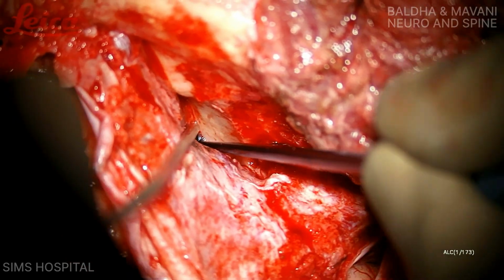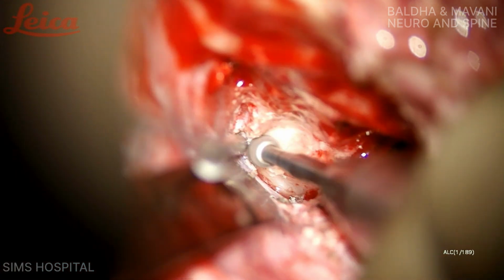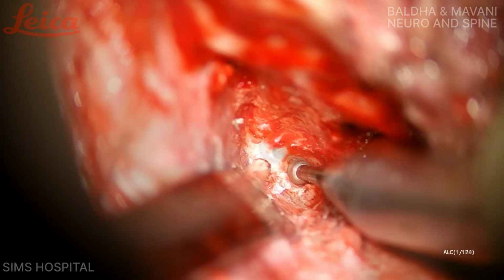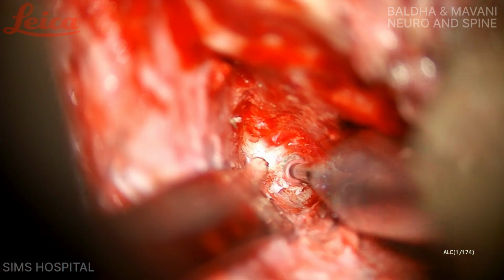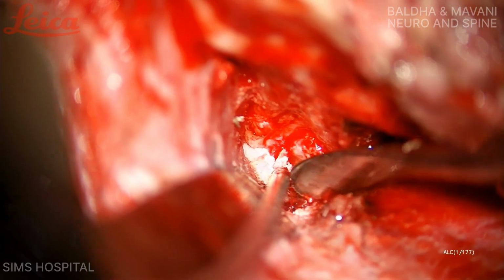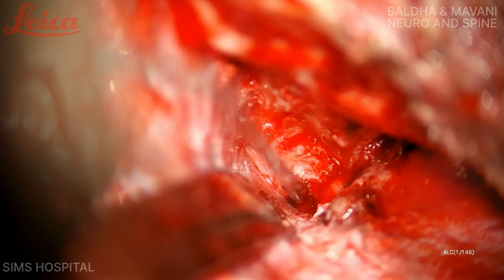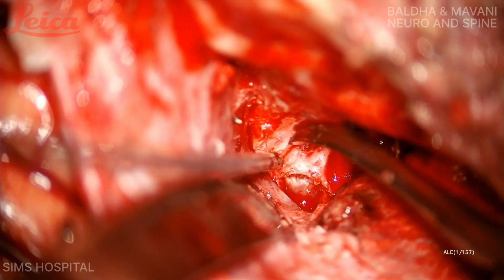Drilling and removal of the anterior clinoid process was performed with an extradural approach. The base of the clinoid process was thinned out with drilling and then fractured with a dissector. The anterior clinoid process is now removed totally in fragments.